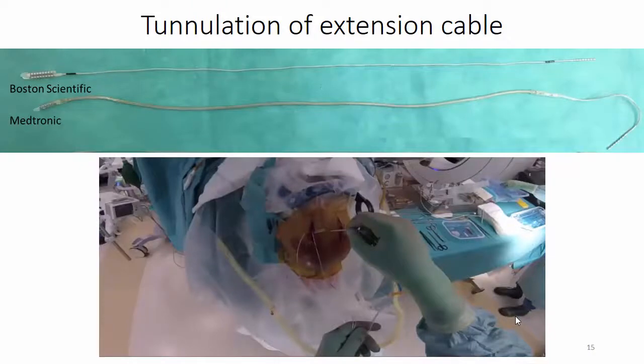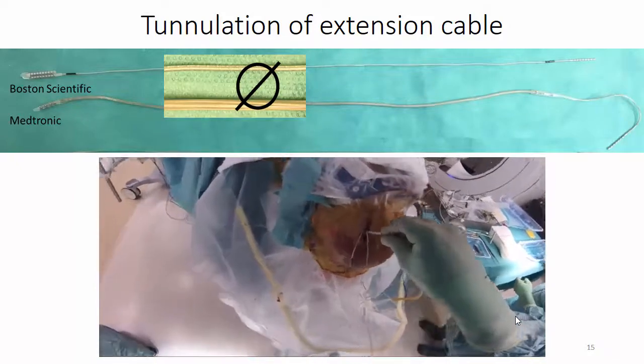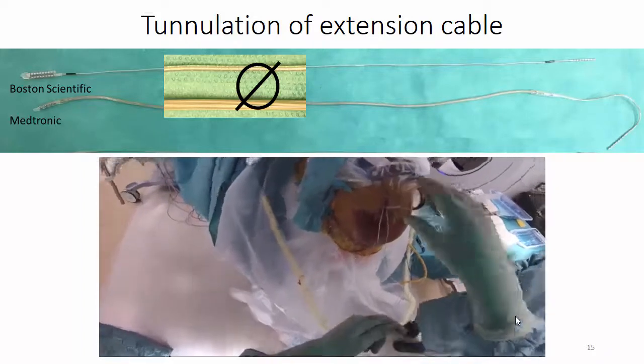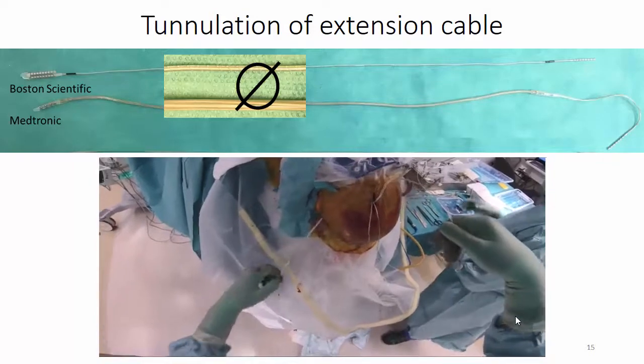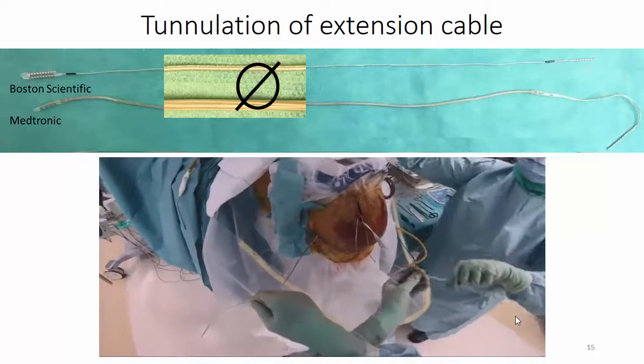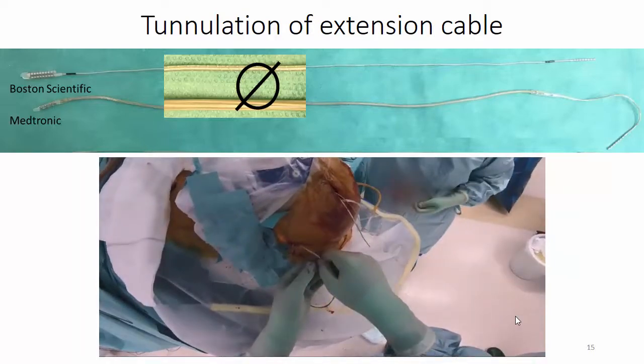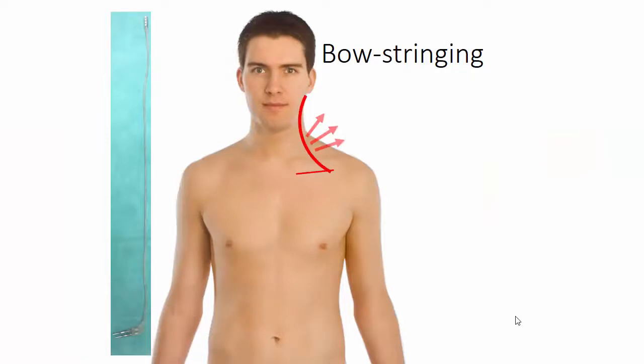The Boston extension cable is very thin and is tunnelated from the cranial incision to the IPG incision, which is the opposite to the tunnelation of the Medtronic extension cable. The extension cables are threaded through the plastic tubes from the cranial incision to the incision behind the ear, and the plastic tube is removed. This is then repeated from the incision behind the ear down to the chest pocket. We had some problems with bow stringing from straining cables with the old extensions from Medtronic. This problem was much reduced with the flexible extensions from Medtronic. Even though the extensions from Boston are not flexible, we have not encountered any problems with bow stringing.